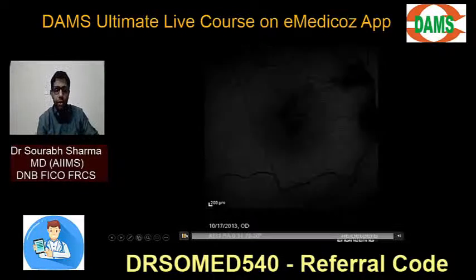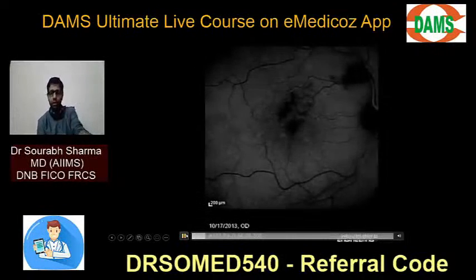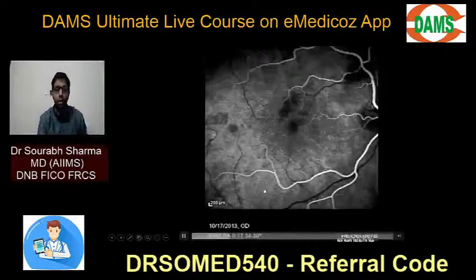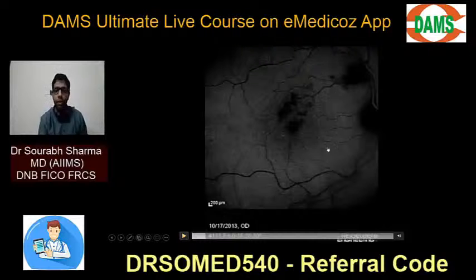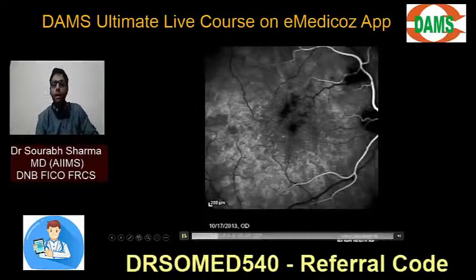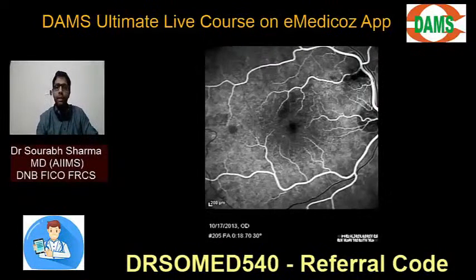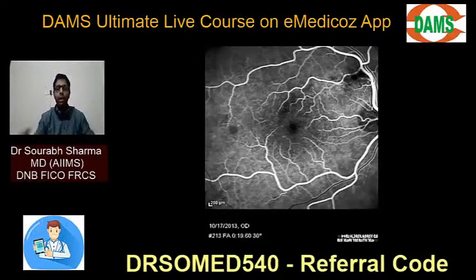Again, I'll show you the video. See again, we put the injection in the vein, heart, choroidal. See, there is choroidal first. If you can appreciate, choroidal flush. And then it comes to the retinal artery. Then it goes into the vein. And then out of the eye. In 10 minutes it goes out of the eye.